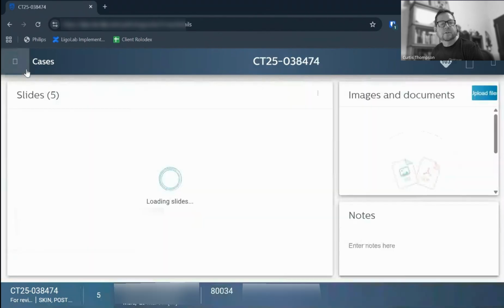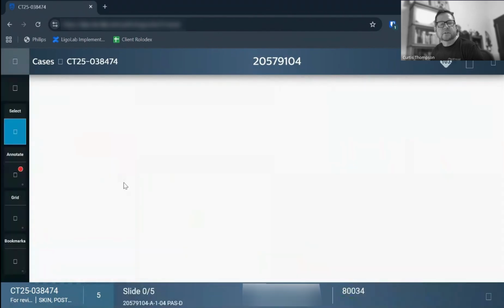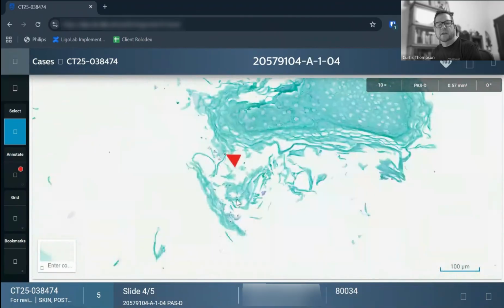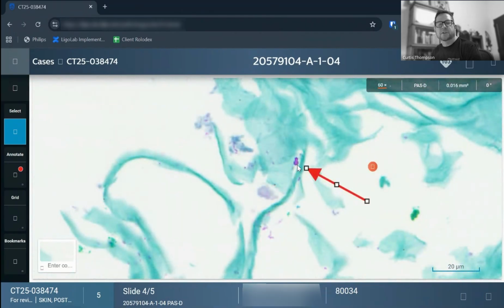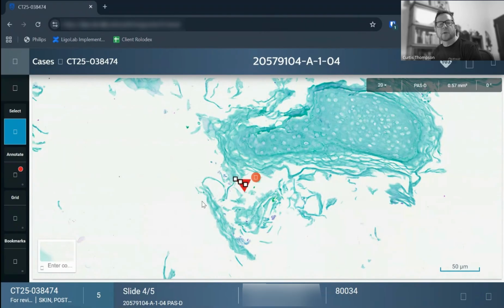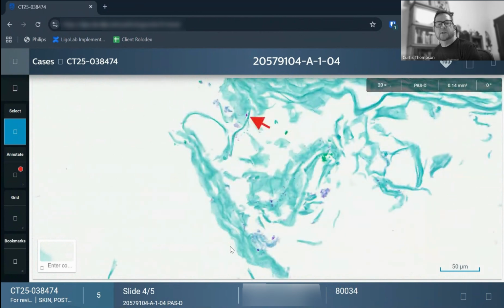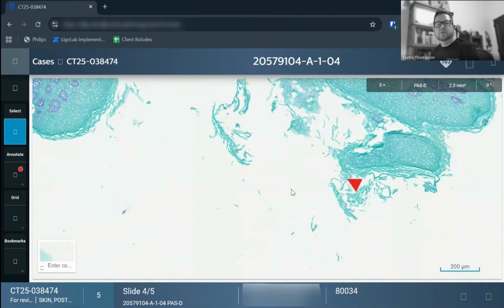And then also noted, this patient also has a typical finding of yeast here. And you can see this flaky what's called orthokeratosis, and this is like the flake you see in dandruff, and it's associated with this yeast that lives on the scalp. So the point for skin pathologists is that you don't see the caps of parakeratosis when you have seborrheic dermatitis in the scalp, and you just see this orthokeratosis. So this is a good case of male pattern hair loss, androgenetic alopecia, with dandruff or seborrheic dermatitis.